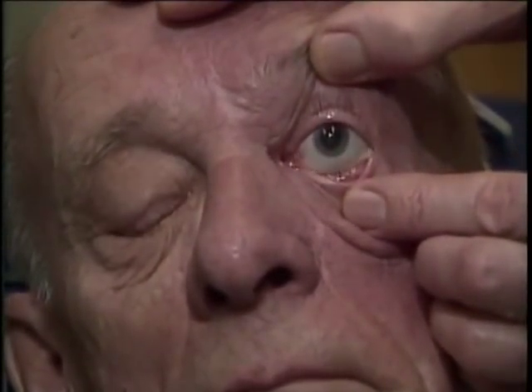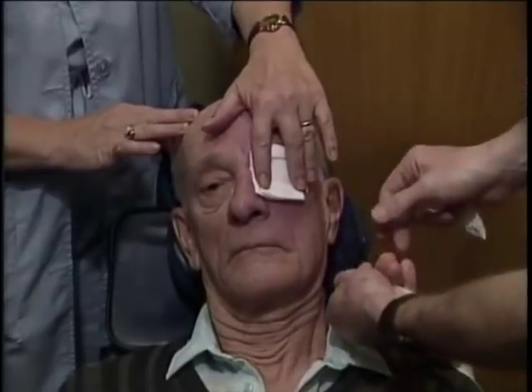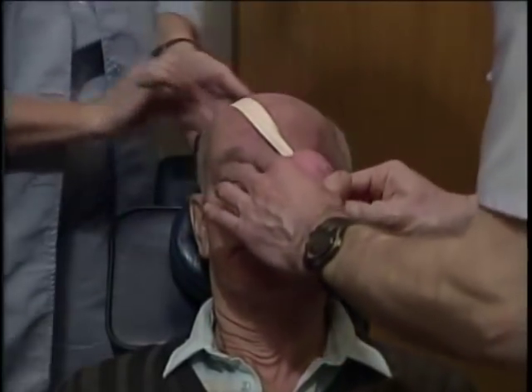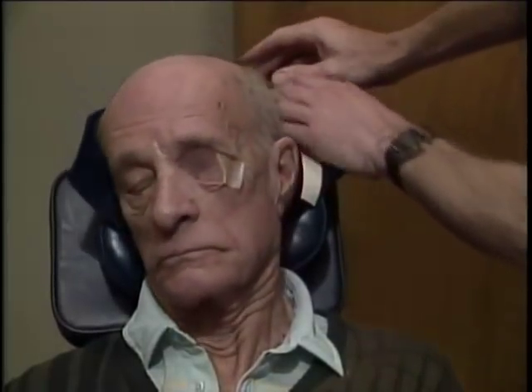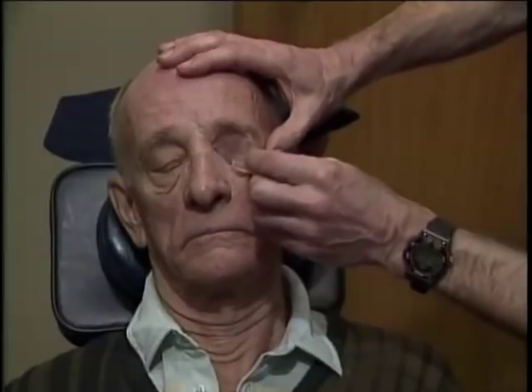The eye movements are checked again and the decompression device is applied. A super pinkie is placed, applying pressure to the eye. The diameter of the ball is such that it arrests on the orbit rim, preventing undue pressure applied to the globe. This is left in place for a 10-minute period, and the eye is routinely checked at that time. Following removal of the decompression device, eye movements are once again checked.